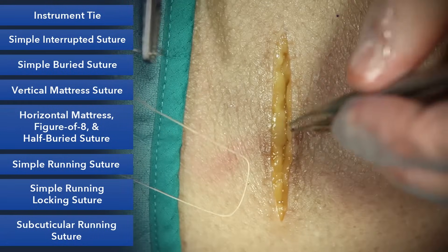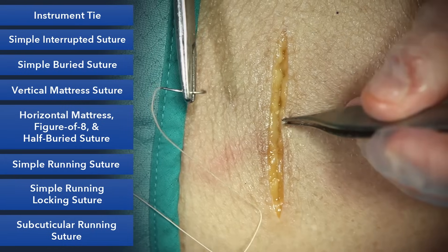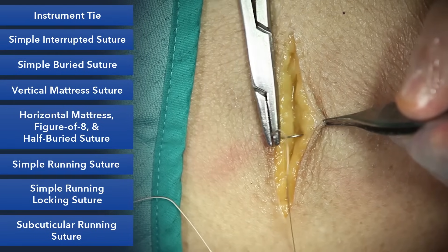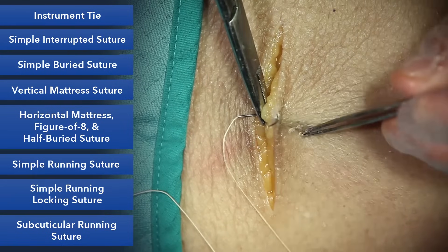Next is a simple buried suture. This will be the main suture you'll use when putting deeper sutures in before placing your skin suture. It's important when burying a suture that we start deep and go superficial, ending up in the dermis without button-holing the skin.